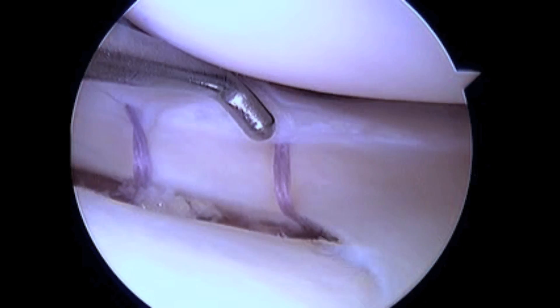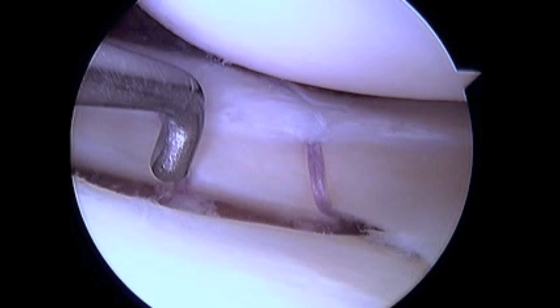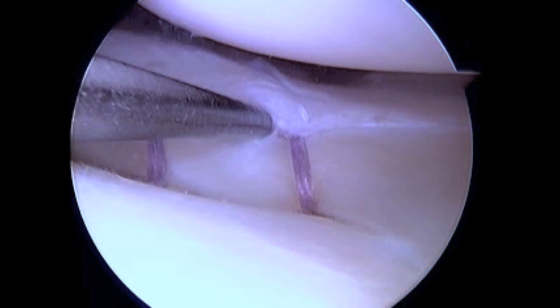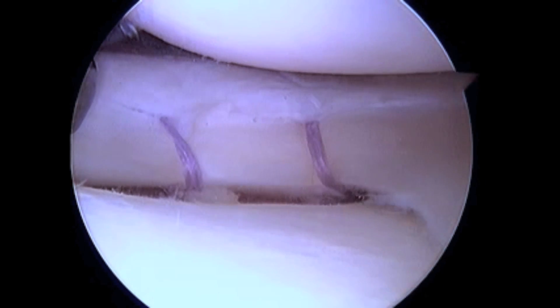Due to the location of this tear being within 3 mm of the meniscal capsular junction and the vascular supply to the meniscus, along with a very secure all-inside meniscal repair technique, I believe that this repair has an excellent potential for complete healing with the patient returning to full function without any long-term sequela.